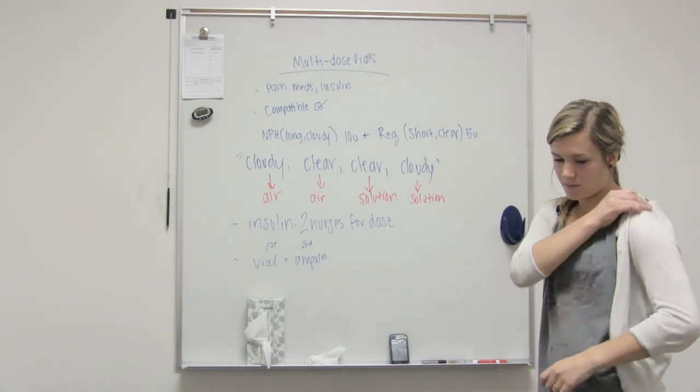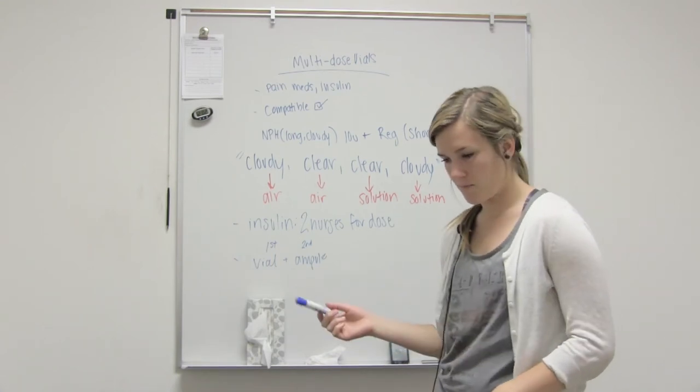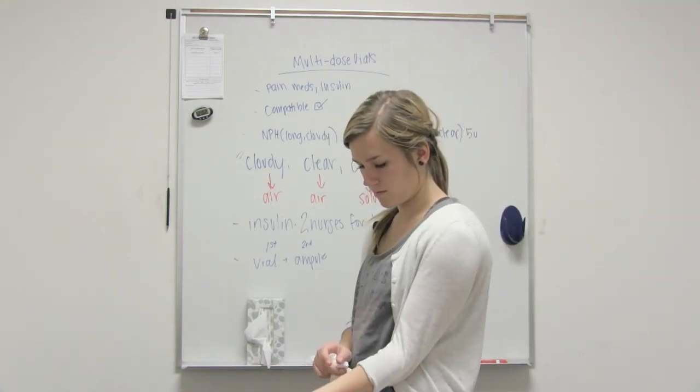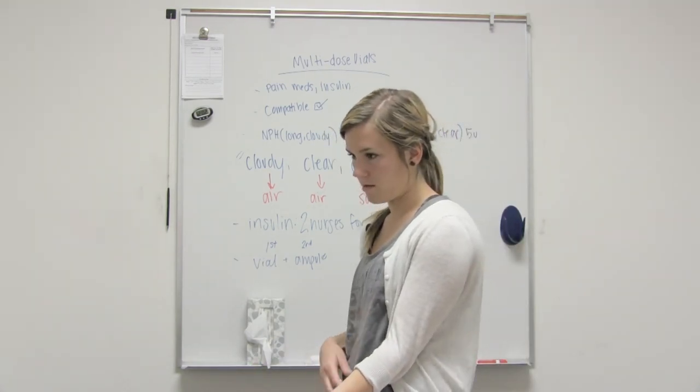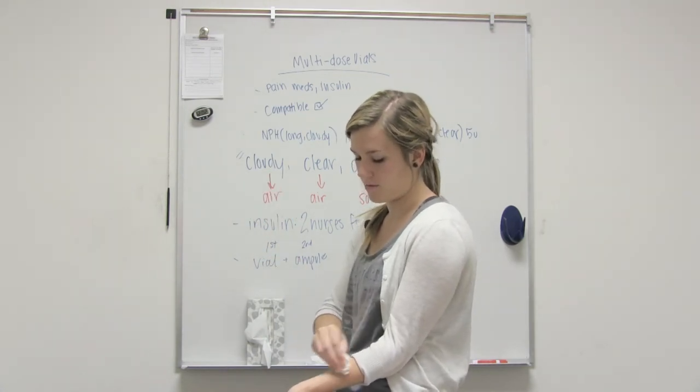Number 24, skin and vial cleansing rules. When you're going to cleanse the skin, say I'm going to do an intradermal right here. You take the alcohol prep and you start where you're going to inject it and go in circular motions outward.